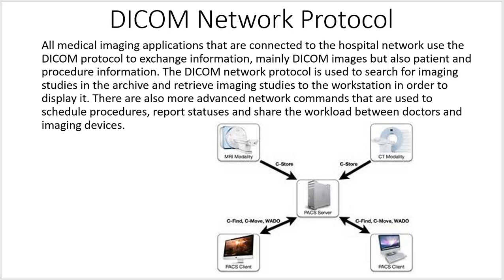The DICOM Network Protocol. All medical imaging applications that are connected to the hospital network use the DICOM protocol to exchange information, mainly DICOM images, but also patient and procedure information. The DICOM Network Protocol is used to search for imaging studies in the archive and retrieve imaging studies to the workstation in order to display it. There are also more advanced network commands that are used to schedule procedures, report statuses, and share the workload between doctors and imaging devices.